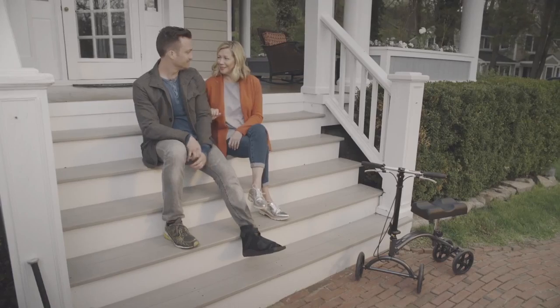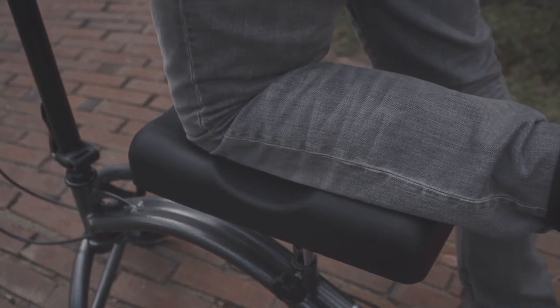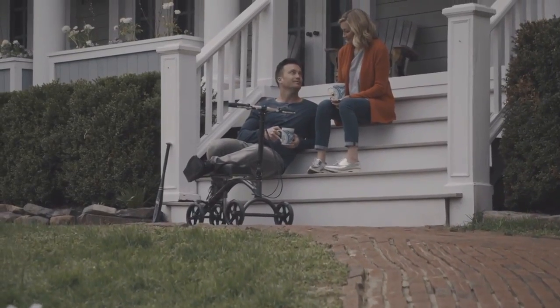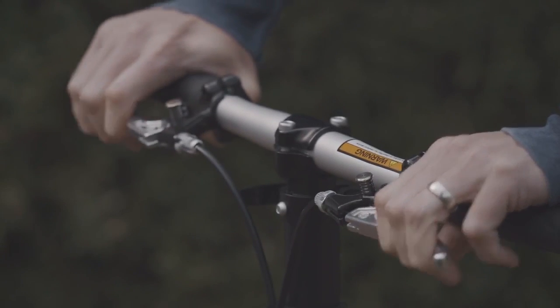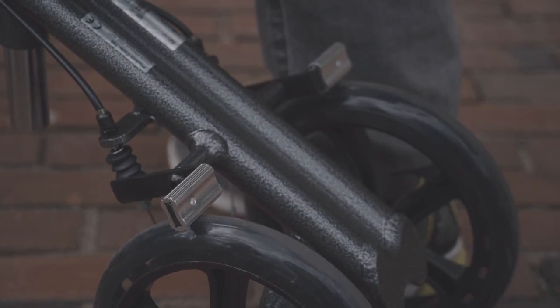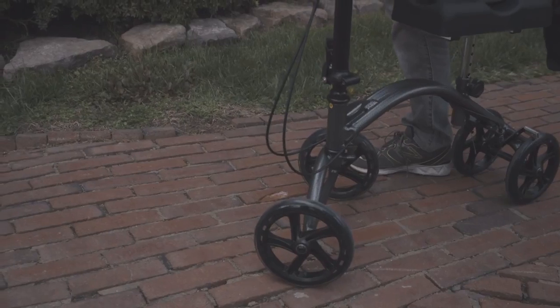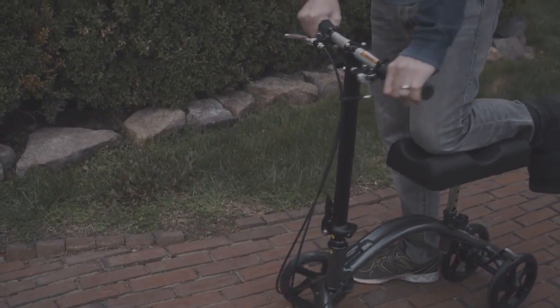I might have to use it after my foot recovers. The leg pad is contoured for a perfect fit, and the padding is durable and comfortable. The dual brakes easily engage and keep Rich safe — it also helps him control his movements. I like that the handles can be steered so I can easily maneuver in the tight hallways at the office.